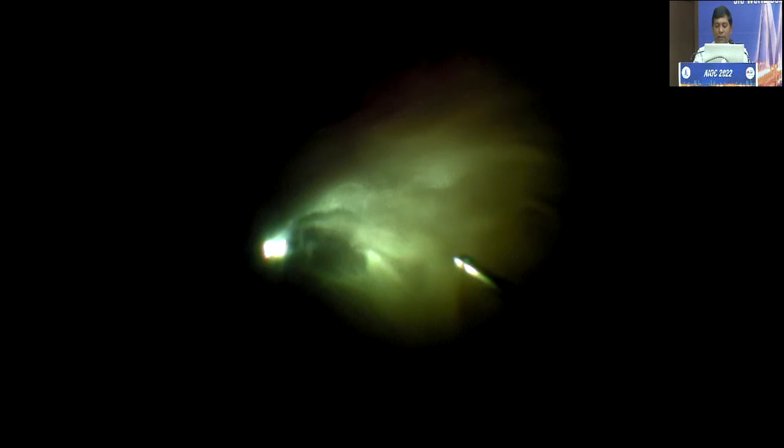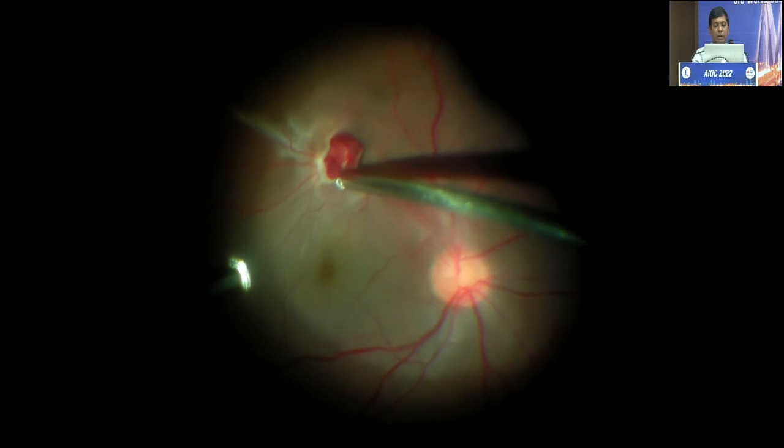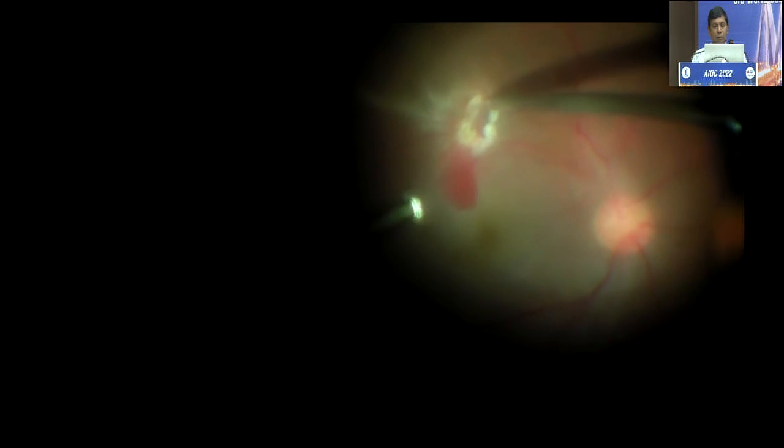I'd now go to case two. This is a glass foreign body, as the history has been given by the patient. There was a glass blast injury. Now in the vitrectomy, the overlying vitreous hemorrhage has been cleared. We are trying to see the impaction site. The retina is incarcerated into the site of impaction.